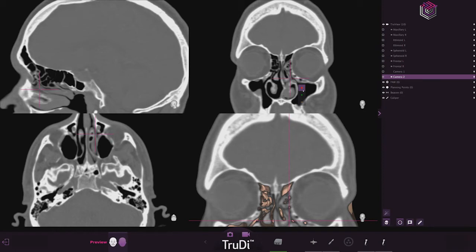What I am going to do is mark this point right here in green, because this is the left maxillary sinus outflow tract. That's where I want to be. Right after that, I'm going to go ahead and put a radio beacon in. What that's going to do is give me auditory feedback right as that wire passes through it. And that's going to be another way I understand that I'm where I think I am, according to a point that I've already planned out.